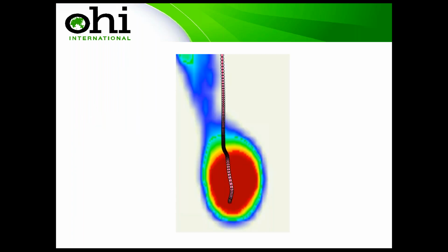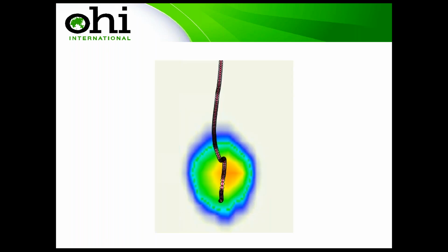How are they represented? Again, very simple. Here's a flag, very quick through the rear foot. Here's another flag, a lovely little area of dark on the gait line. That dark is rotation. That means this foot's no longer moving forward, it's now rotating. And it'll either rotate in the transverse or frontal planes. Can't do anything else.